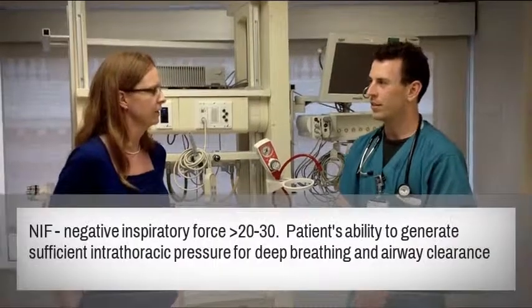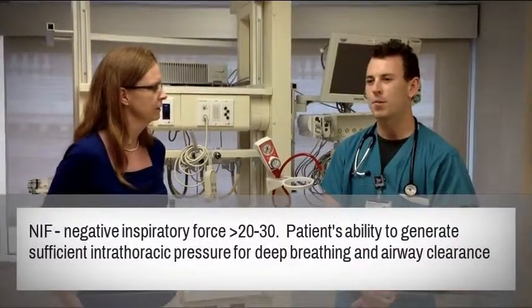What's the RSBI and the NIF? Okay, so the Rapid Shallow Breathing Index, or the RSBI, also known as the Tobin Index, is a parameter that you can use to assess someone's readiness for extubation. It's pretty much their respiratory rate divided by their tidal volume. The lower the number the better, less than 105, but pretty much we look for anything less than 50 as a good number.